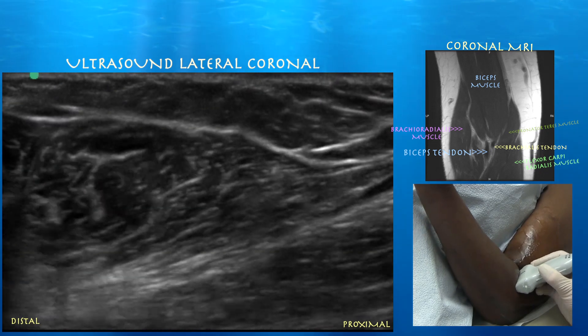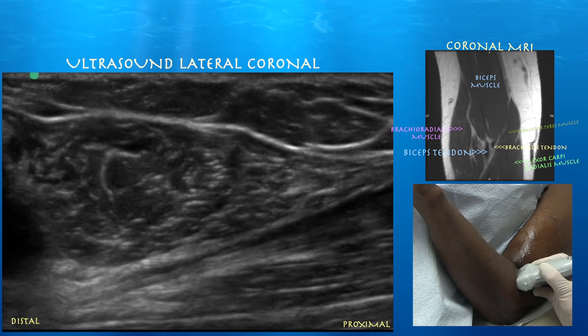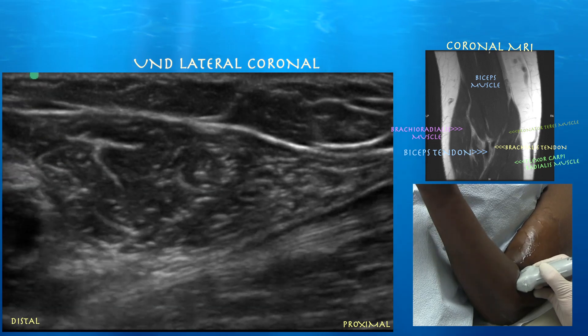Here you can see some nice motion — the biceps tendon coming in and out of view with pronation and supination.